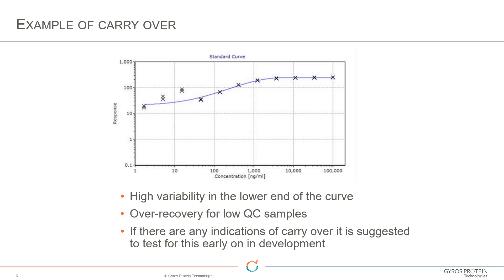One thing people suggest is reversing the pipetting order — starting low and going high rather than high to low. You can do that, but the carryover is still there. You're just hiding it. You don't want to hide it — you want to see it early and fix the problem so you don't get over-recovery with your QC samples.